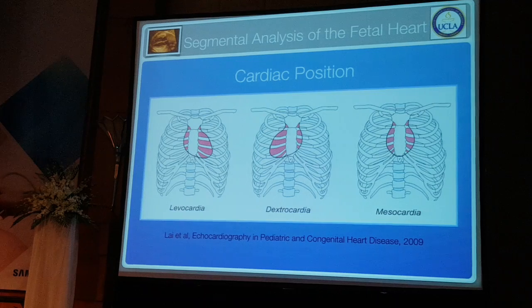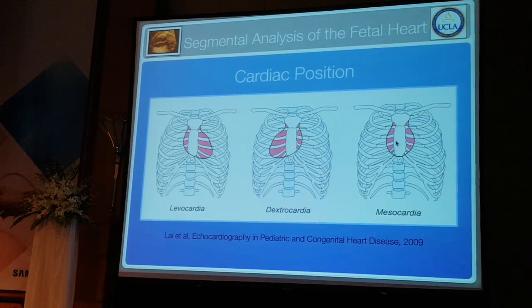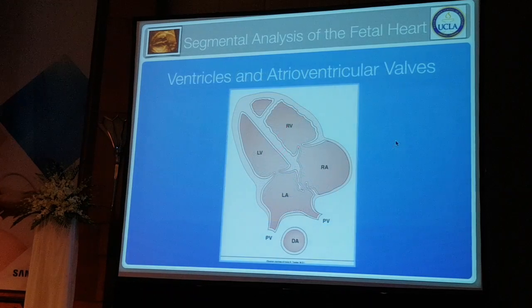Then, of course, when we look above the diaphragm, you want to see where is the heart? On the left, on the right, or in the middle? Then we want to look at the ventricles and the AV valves, the mitral valve and tricuspid valve.